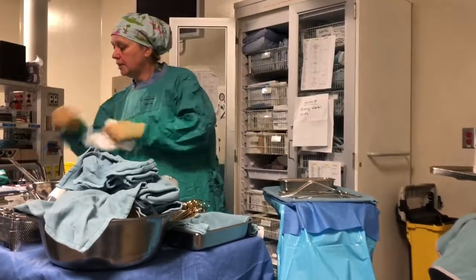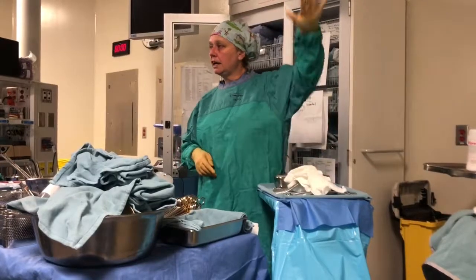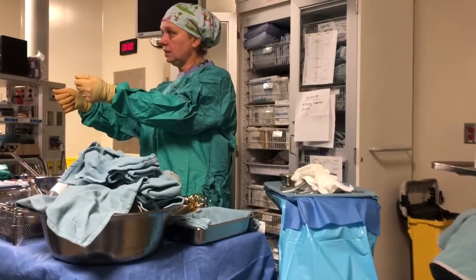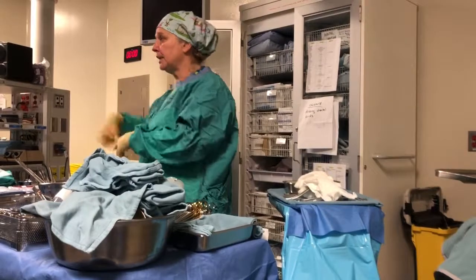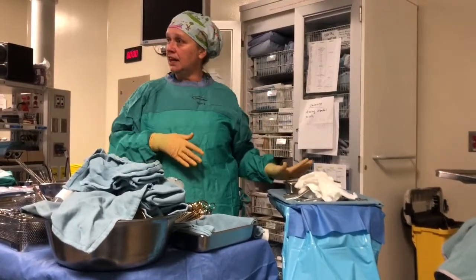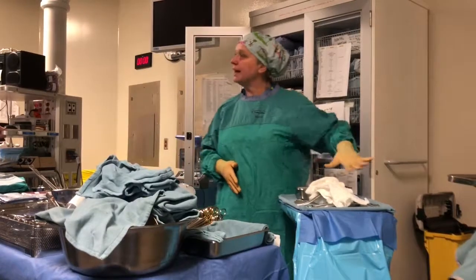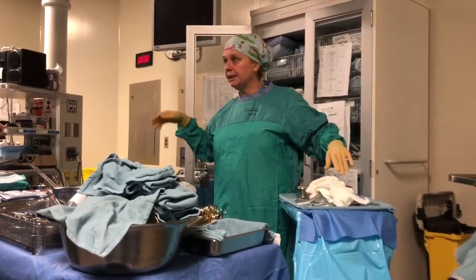I would put my sponges up here. I'd have 3. I'd have my cautery, I'd have my suction, and then all I have to do is push that up, and it's going up and over the patient, right? They can get the suction up, they can get the cautery up, they can clamp it with the Kelly because it's on here, they can pull the sponges up, they have a knife, right? And at that time, I'm kind of bringing my table in, right? So I have this all ready for them to get started, because if we're in an emergency, they need to just get started, right?